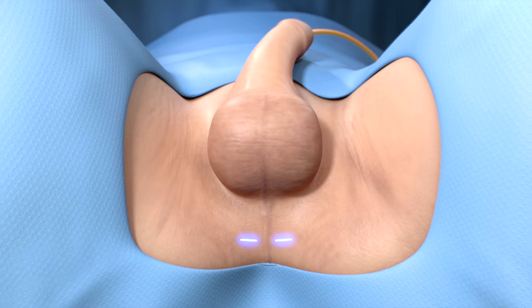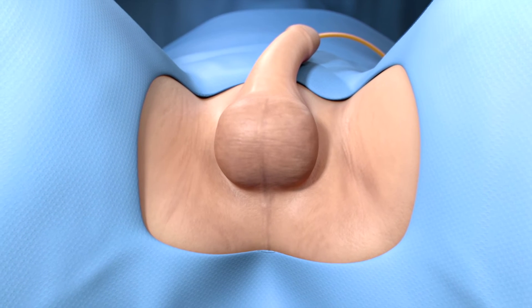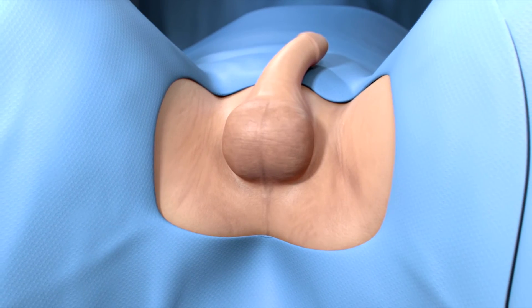The filling ports are placed underneath the skin of your scrotum and the incisions are closed using two or three stitches for each incision.